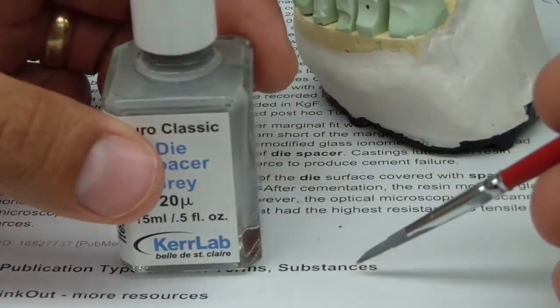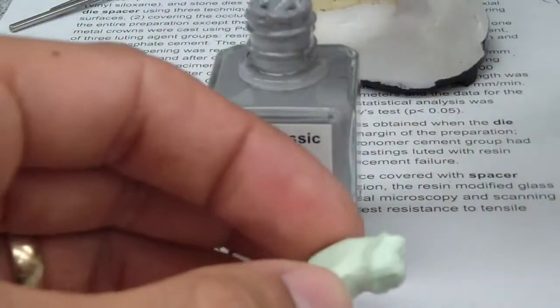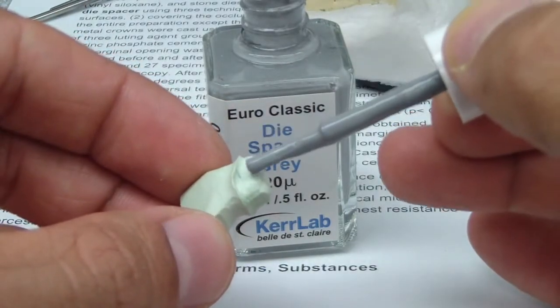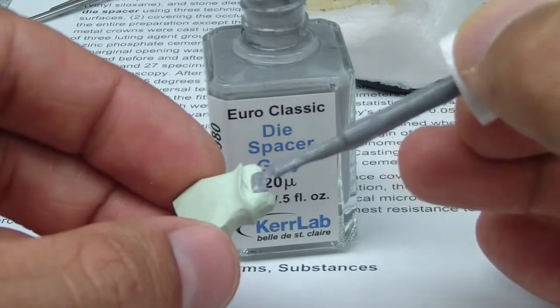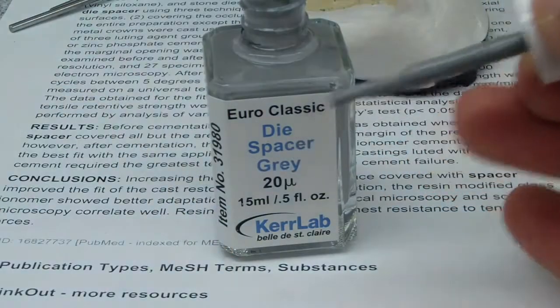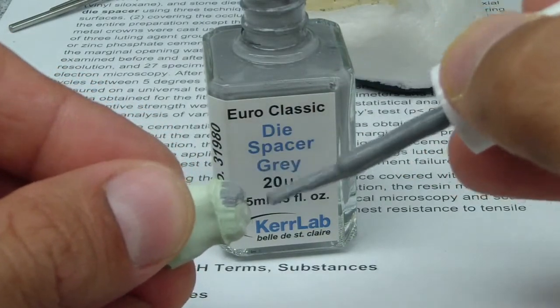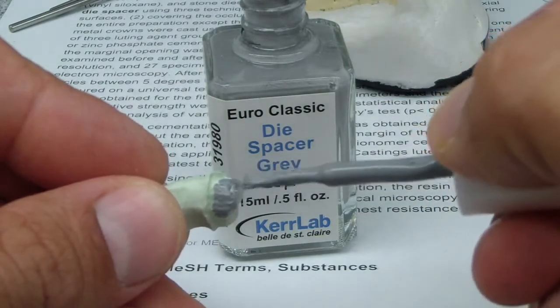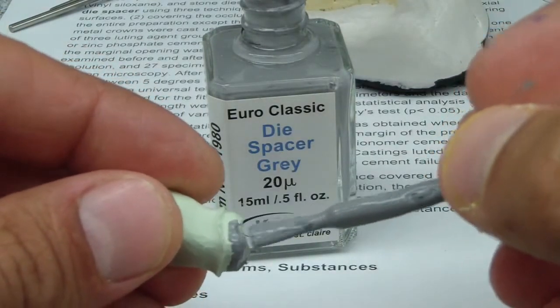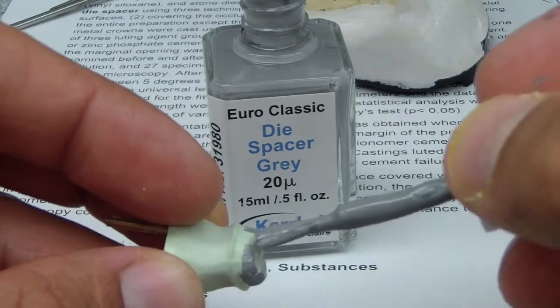You can place this in a little dappen dish and then use a brush, but honestly, probably 99% of the world does it right out of the bottle. So we're going to do one coat, try to go 0.5 millimeters short of the margin — there are many ways to do this. These are going to be PFM crowns, and you can see how it's tacky there — it's already drying. You can use thinner to thin out your material, even in a dappen dish or thin out the entire bottle.